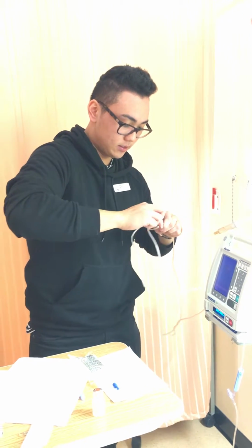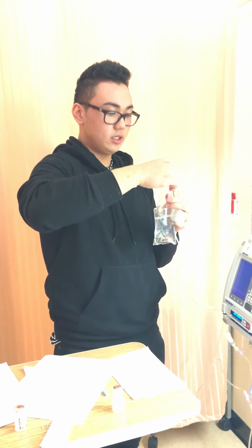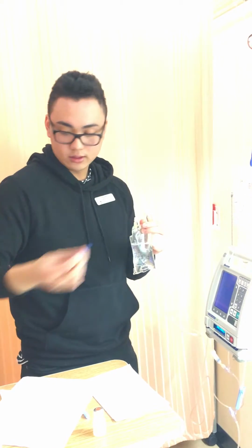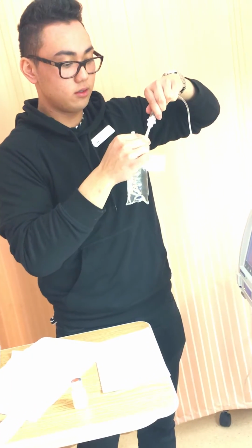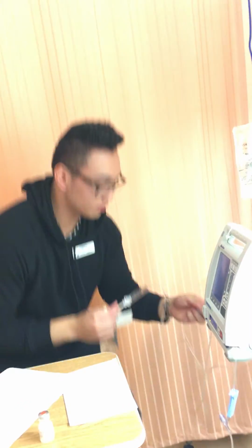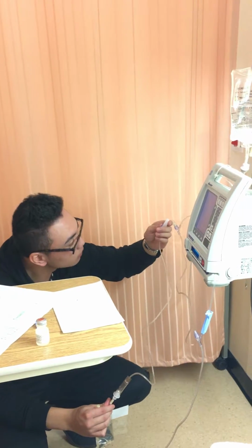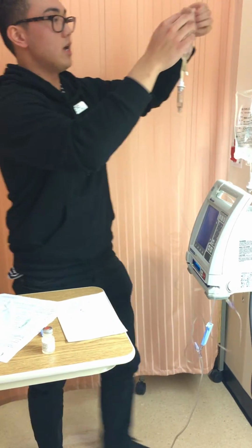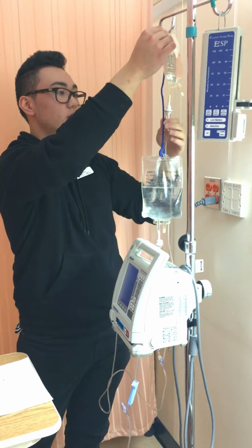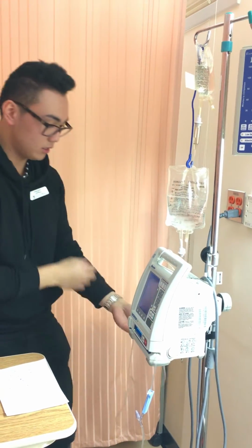Okay. Okay. And we will connect the tubing to the bag, maintaining sterility, making sure that the spike does not touch anything else. Okay, now we will back prime, so we will lower this below the primary, making sure that there's no air bubbles within the line here. And it looks pretty good. Pull the clamp off. And I have to make sure we have 1/3 to 1/2 of this chamber filled with fluid. Okay, we'll close off the clamp here.